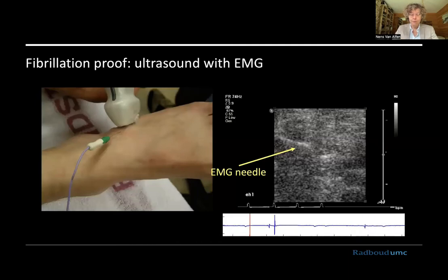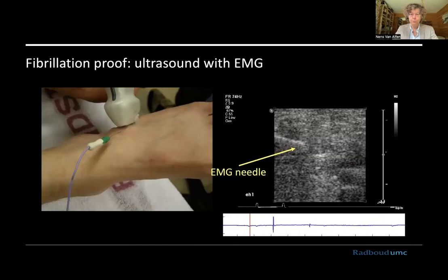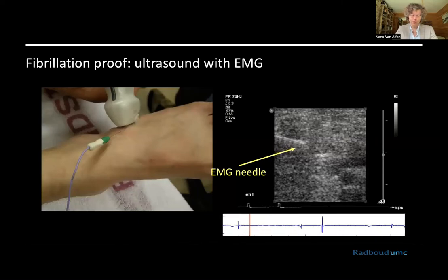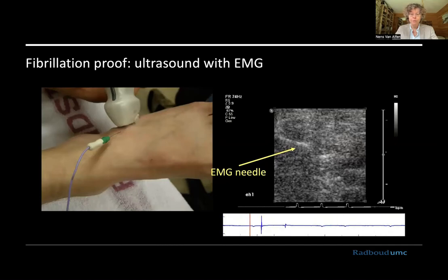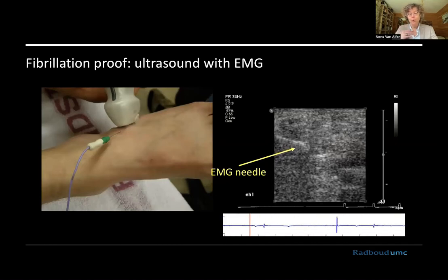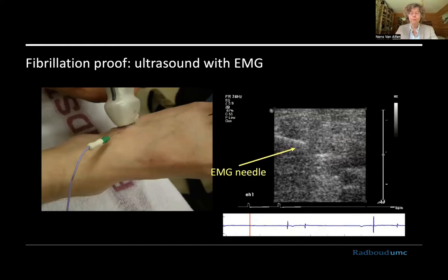We also did a study where we de-innervated extensor digitorum brevis muscles using botulinum toxin as part of an experiment with end plate zones. As a side test, we inserted an EMG needle — which you can see in the zoomed-in ultrasound image — and recorded the ultrasound and EMG needle signal simultaneously. And these are just fibs. If you've heard them before, you'll recognize them.